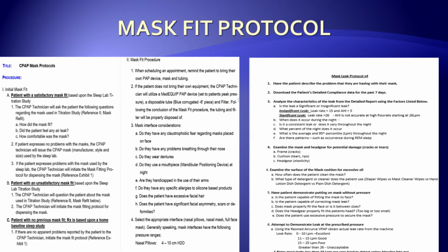I've worked at a large number of hospitals and home care companies who had excellent policies and procedures covering nearly all the respiratory therapy activities. However, when it came to mask fitting, there was hardly any policies or procedures to be found. It was assumed that respiratory therapists had this very instinctive notion and knowledge of how to do it without much training, and no policies were needed.